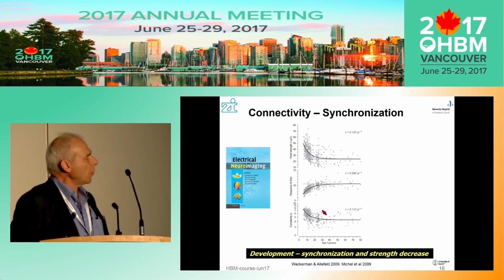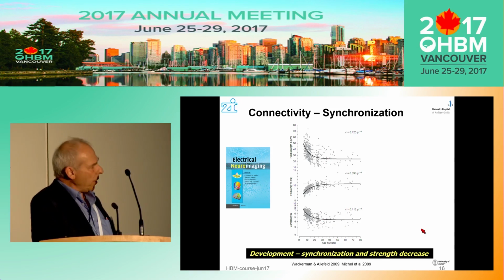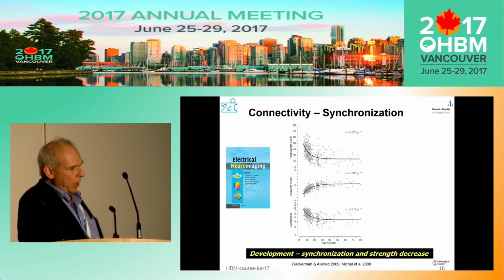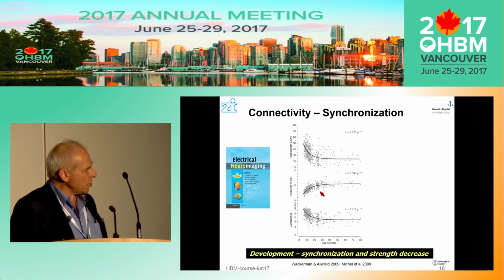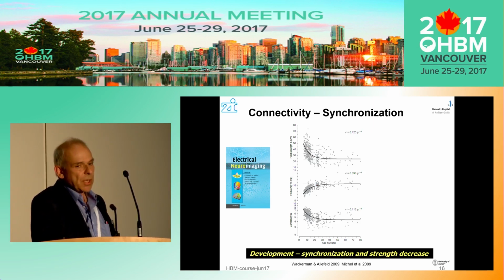Essentially, this is the complexity, which essentially parallels the development of the reduction of field strength, probably due to synaptic pruning over the early years, particularly the early years until puberty of development. Okay, and if you look at, instead of complexity, if you look at synchronization, then you have the opposite pattern. Now the question is really whether these global measures tell you anything.